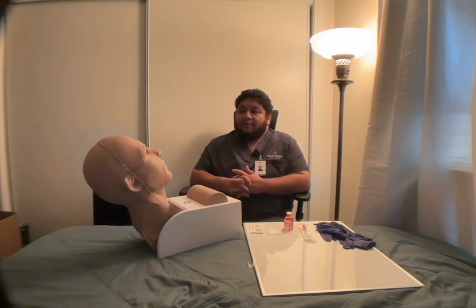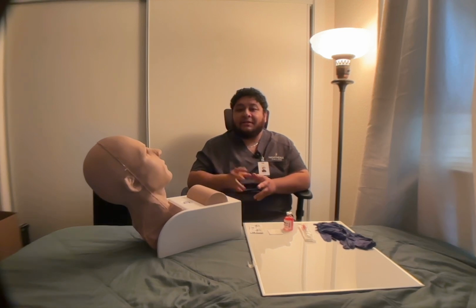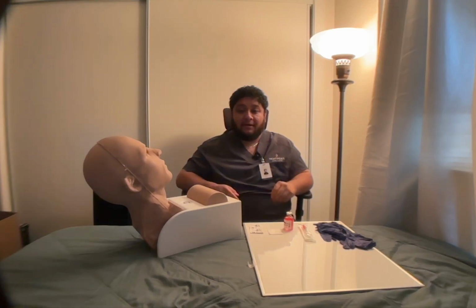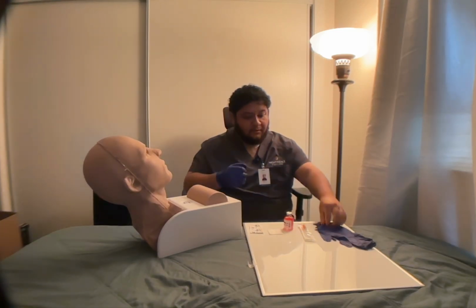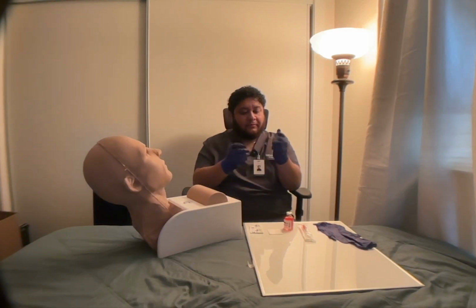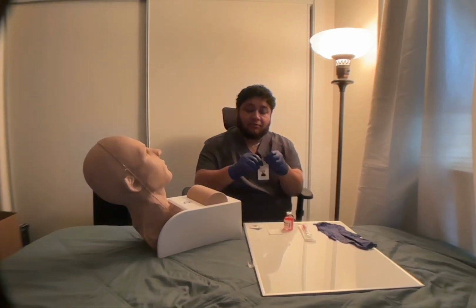Okay? I will prepare the medication now and verify it for the 3rd time. This is the 3rd time that I verify that the medication goes to the right patient. I'm going to perform hand hygiene and apply my clean gloves. Gloves are on. I will start by cleaning the top of the vial with an alcohol swab.